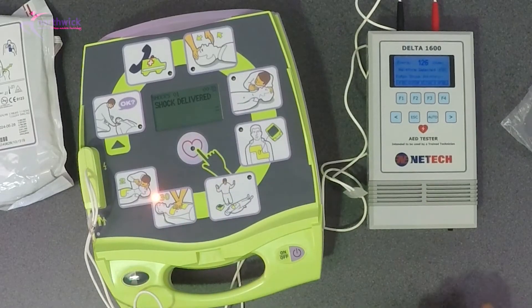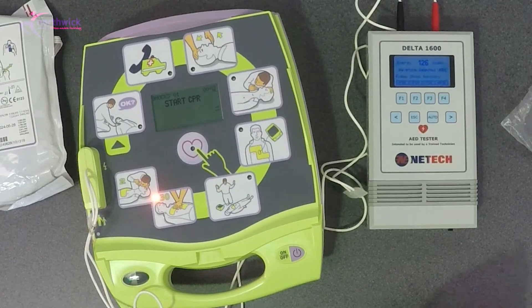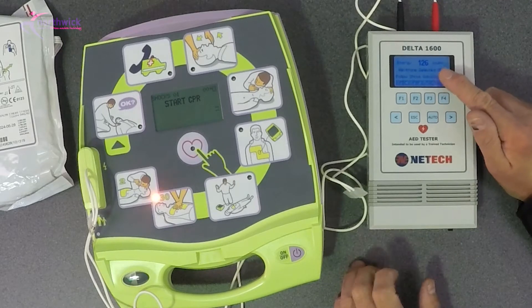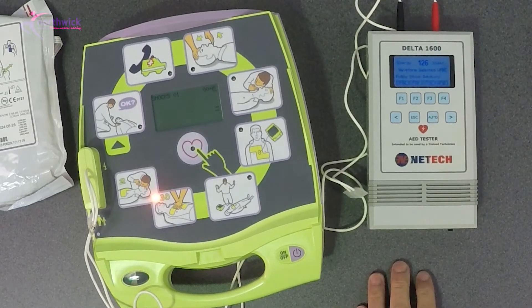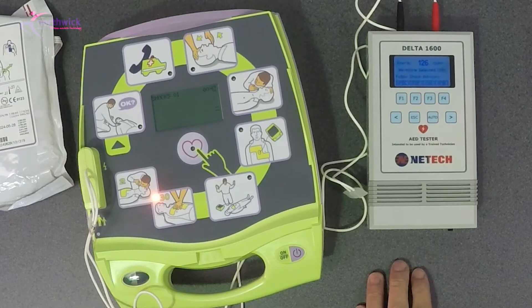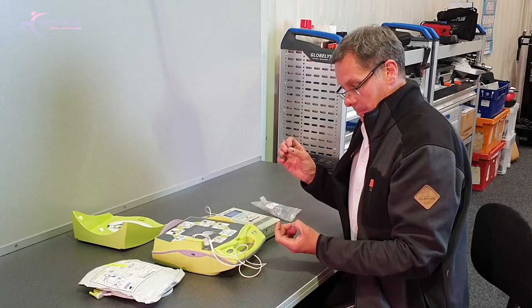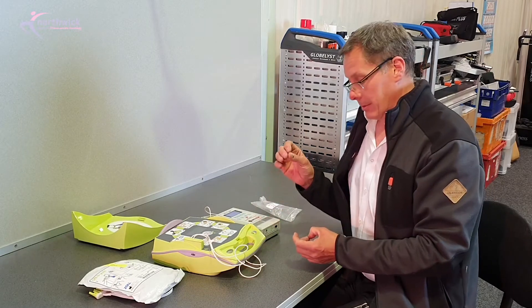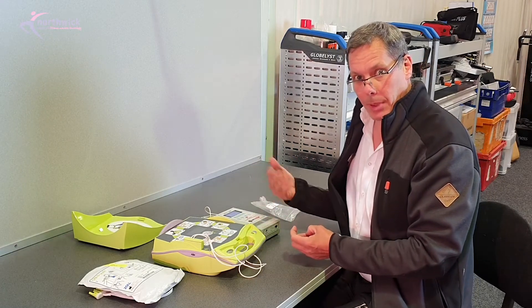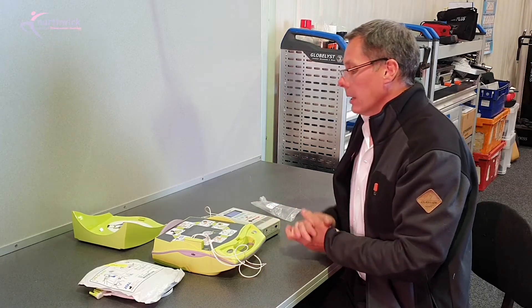Because this is a semi-automatic defibrillator, which means I want to press it. Shock delivered, start CPR. And on the test equipment we can see that we've got 126 joules of energy has been delivered. So not only are we able to actually continue CPR and check that the device is delivering a shock, we're also able to measure the amount of energy that's been delivered.